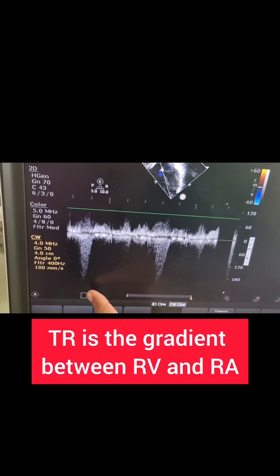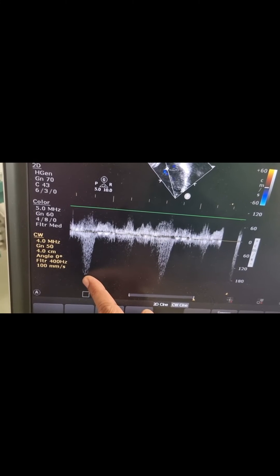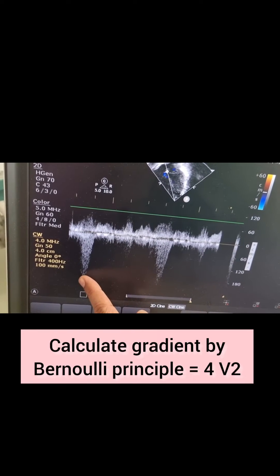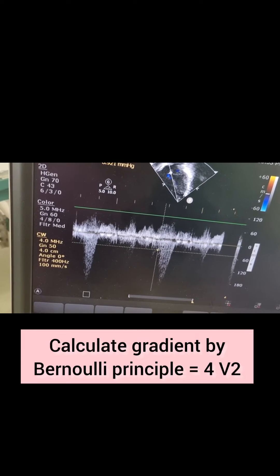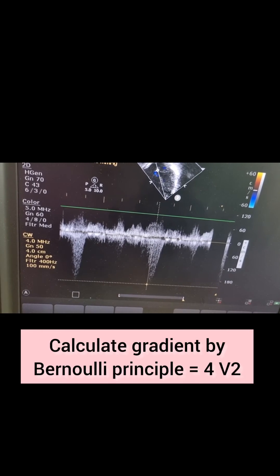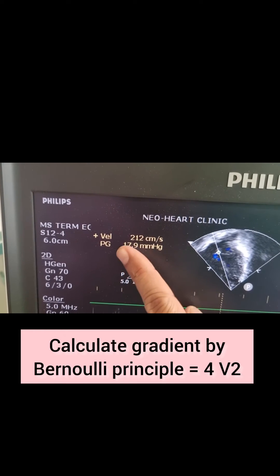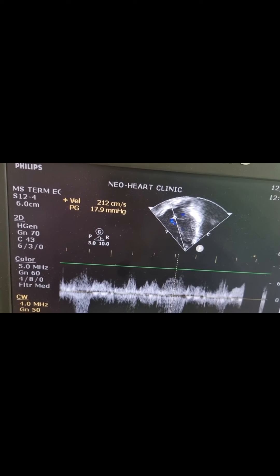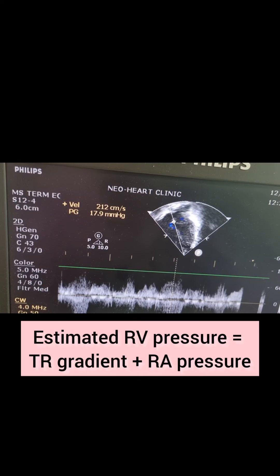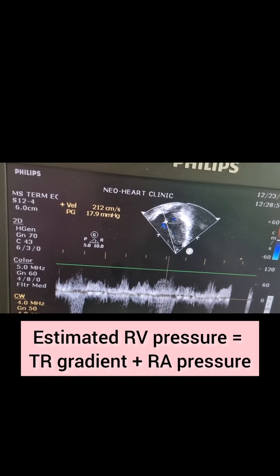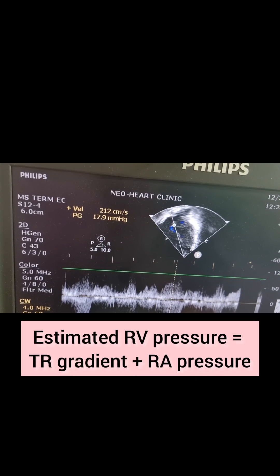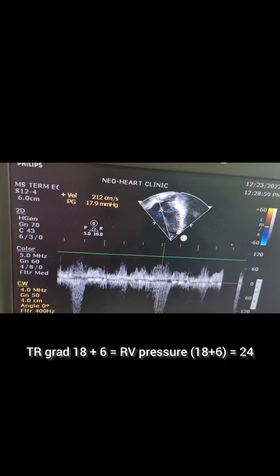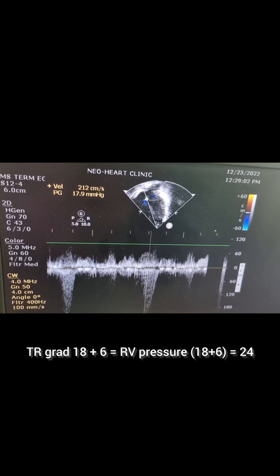What you have to do is calculate the peak velocity, and by Bernoulli's principle the machine will automatically give you the TR jet gradient. As you can see, the gradient is almost 18. The right atrial pressure is around 6 to 10 millimeters of mercury. So this is the gradient calculated between RV and RA, and you add 6. So 18 plus 6 equals 24 — and 24 will be the final estimated pressure of the right ventricle.